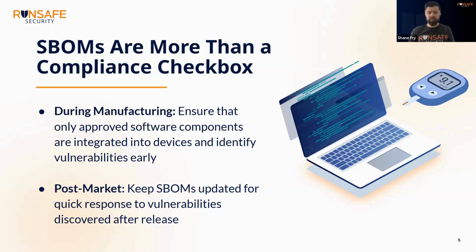And then on the post market side, we want to make sure that those SBOMs are constantly being assessed. So if I generate an SBOM today, run it through some tooling and get a list of vulnerabilities, great. Let me go act on those. But then a week from now, a month from now, who's tracking those vulnerabilities in that software that's already been shipped? Because you may need to come back later and say, oh, this new vulnerability in the Linux kernel is present. We need to patch, or we need to deploy some other mitigation. Put a workaround out while we're sorting through getting this fixed.